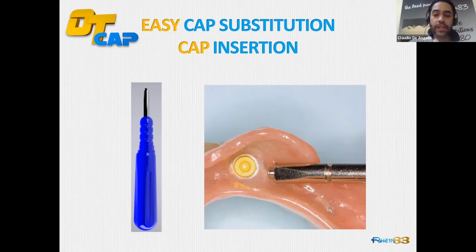If you have a metal frame, or a metal housing, or at least a single metal housing, it's a job of 2 minutes. Okay, very easy, and you have no possibility to have problems, mistakes, or whatever.